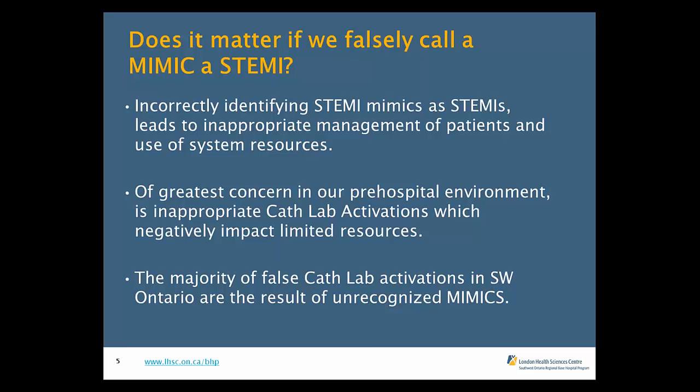You know, getting patients to the right hospital at the right time often requires mobilization of resources, especially at PCI centers. So, we're lucky here with certain hospitals, PCI centers, where the cardiologists actually do get to see or transmitted the ECG and can look at the ECG and agree or disagree with both the computer and paramedic interpretation. But there are some systems where the PCI team gets activated without actually seeing that ECG. And that does cost the system money. So there are some downsides to falsely activating the STEMI bypass.